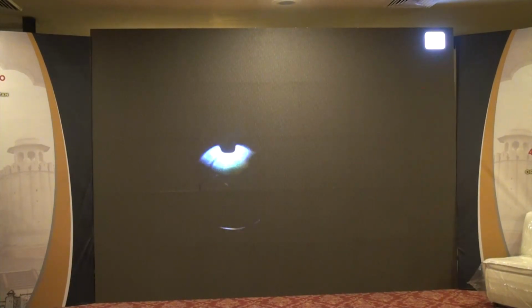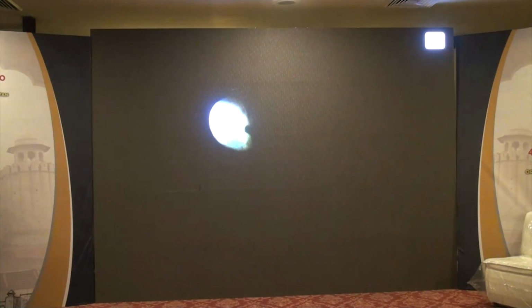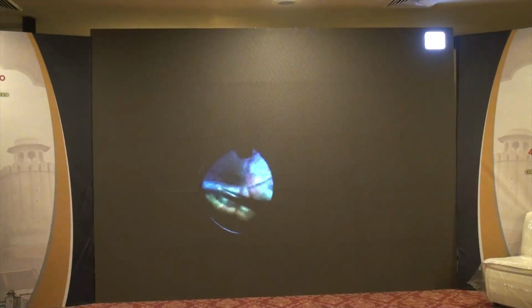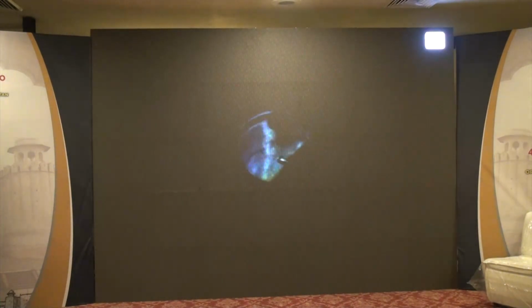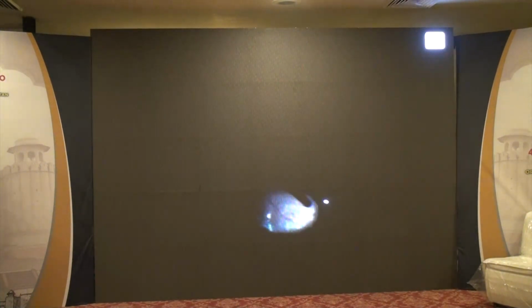Apologize for the quality of the video. So not only am I checking how many are there, but also how badly they are elevating the retina. This one is going inferiorly.